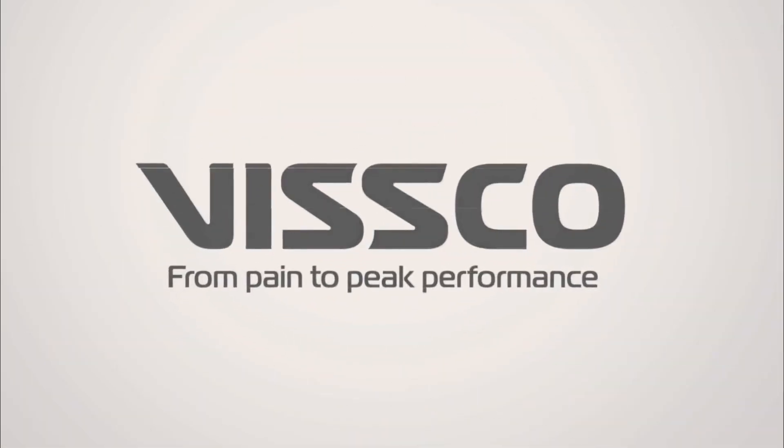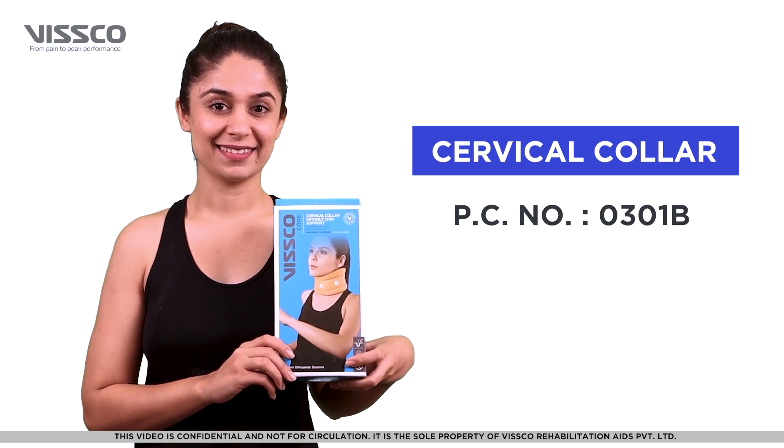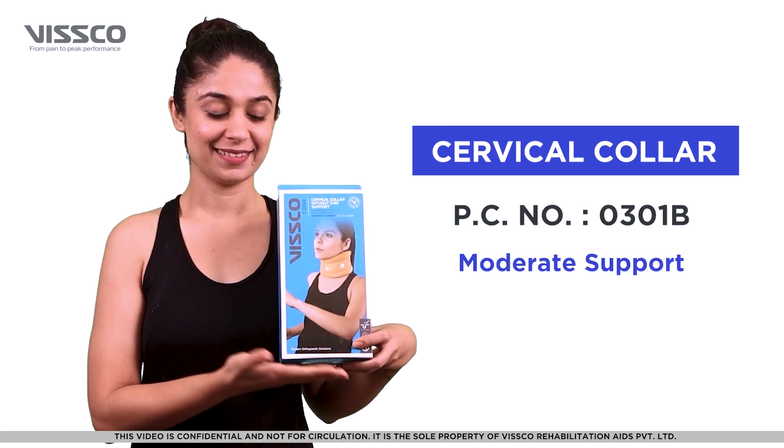Hi there, greetings from VSCO. In this video, let us learn how to wear the VSCO cervical collar, product code 0301B.